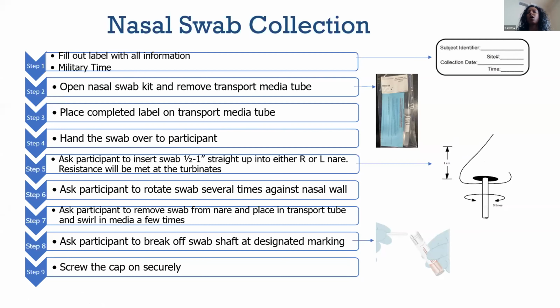And then take the swab, put it in the container, make sure you mix it around with the media, and then break it off at the marking that's on the edge of the shaft there. And then just screw on the cap.